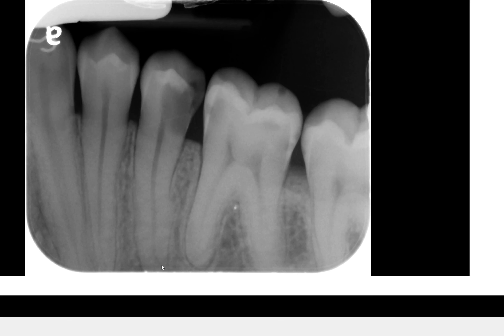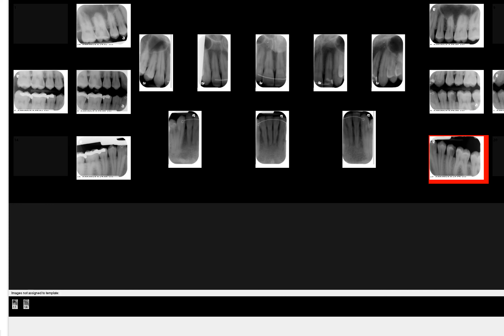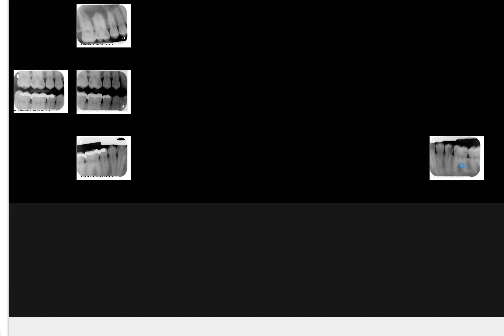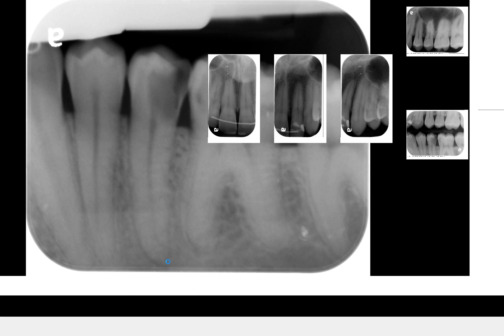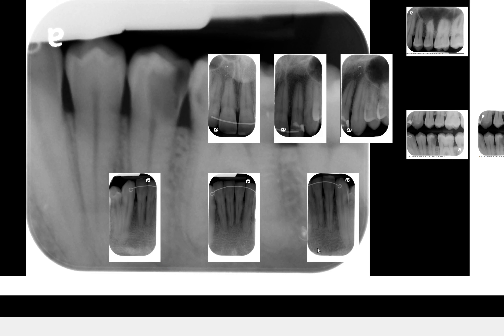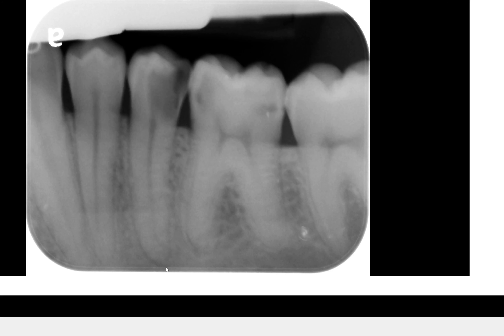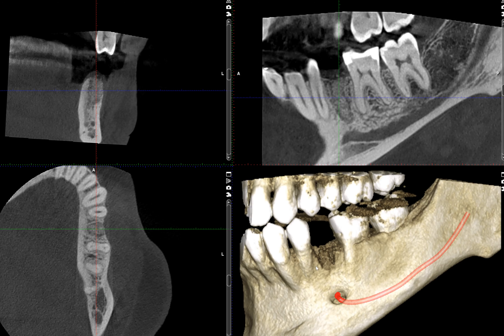In the periapical radiograph, we're barely capturing where the root apex is missing. Once again, we barely capture the apex of the tooth, and it's very difficult to visualize where the mental foramen is. But it's very clear in this 3D rendering.